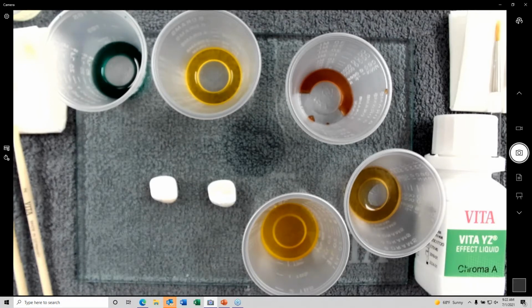And so as you're grinding away, you are losing some of that pigment. You're less likely to grind through it than you would be on a surface stain, like a stain and glaze. So yes, it will affect it. Hopefully you're not grinding so much that it's going to affect it very much.